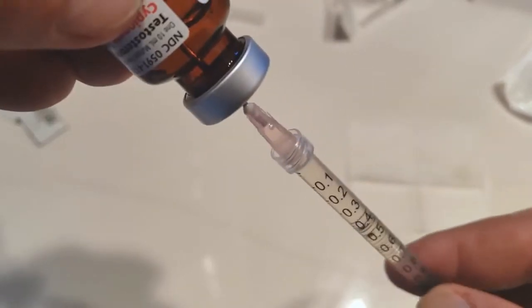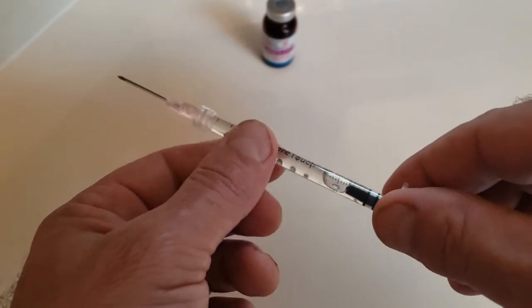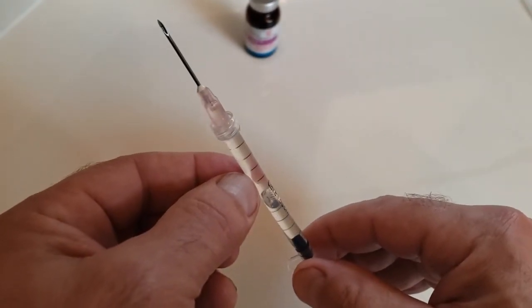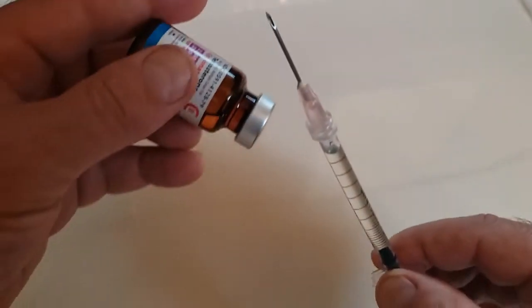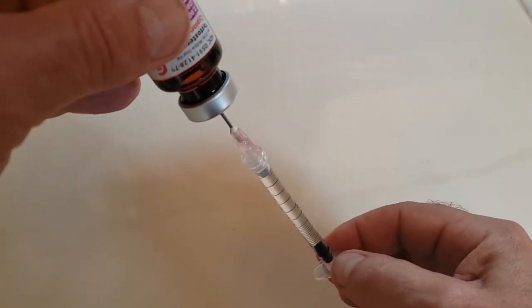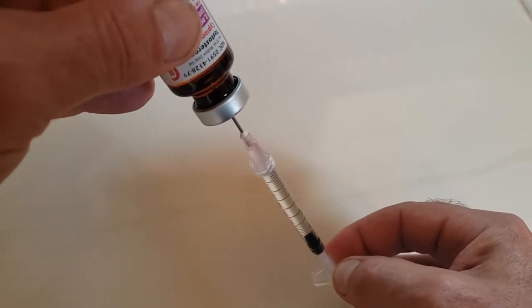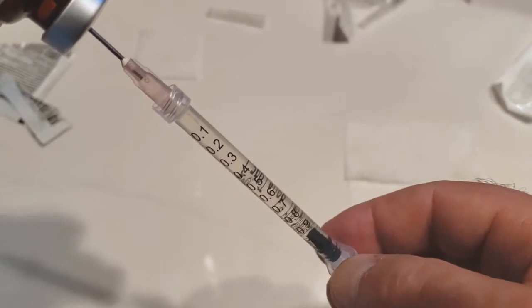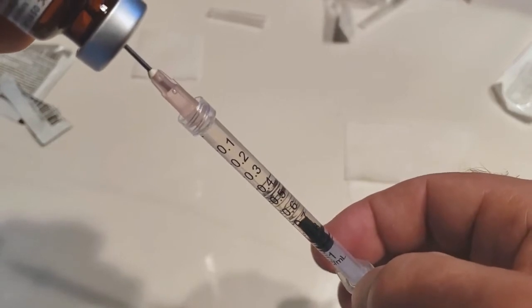Make sure you get all the air out of the column. Usually there will be a bubble of air within the column of medicine. To remove it, turn the syringe vertically until the bubble reaches the top, then inject that air back up into the bottle. Watch the plunger go to the 0.8 mark.